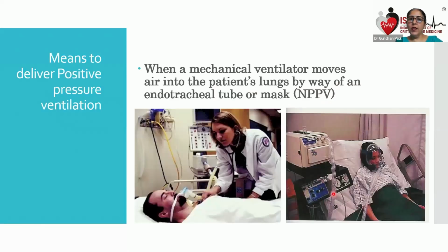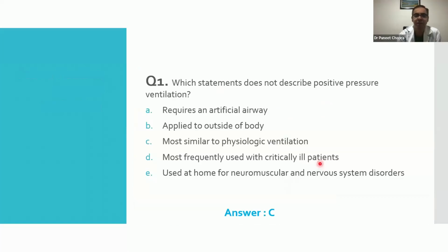So mechanical ventilation can be... Many people have answered C. Yes, that is very good. That is not, because mechanical ventilation is positive pressure ventilation and normal physiological ventilation is negative pressure ventilation.